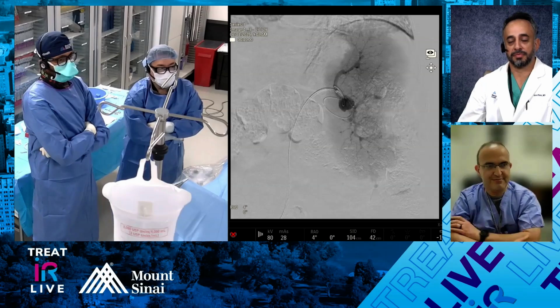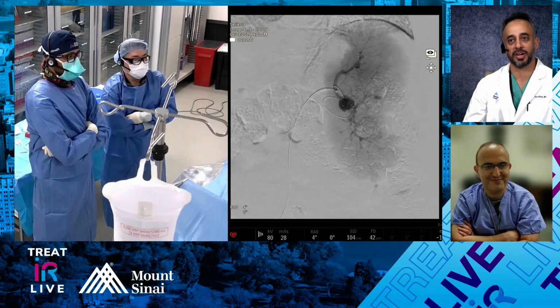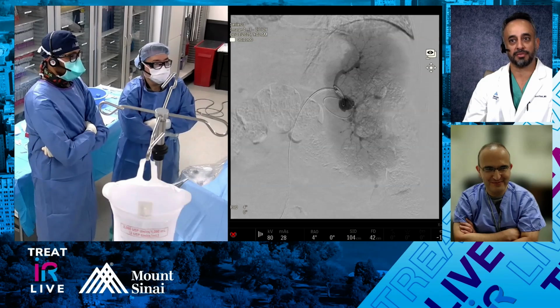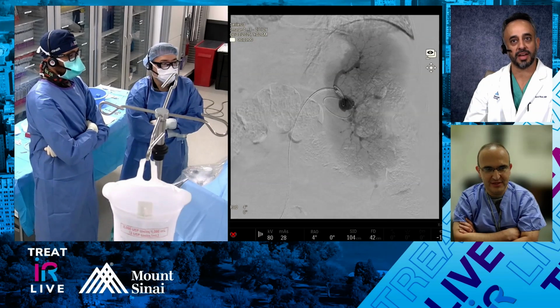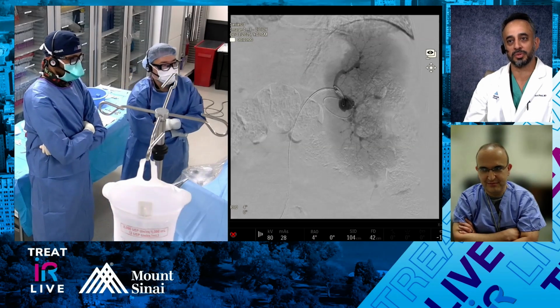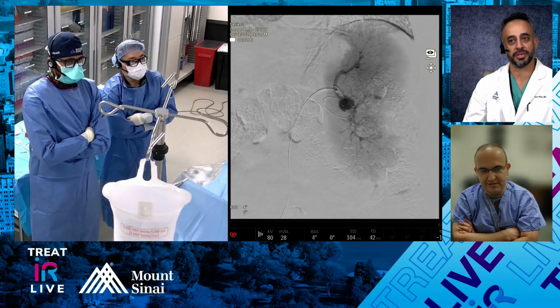I don't know if Dr. Cohen has any different feelings on it, but it always looks like, oh, this would be a great case to do a stent or try to put in a covered stent. And when you get there, there's no way, given all that tortuosity. If you look at the microcatheter whipping around back and forth there, no stent is going to track out there that's big enough. Especially trying to get a Viabahn or a VBX out there. It was very proximal. That's probably where you could do a stent, and then it's sort of pointless at that point, right? Because it's so proximal that it's just easier to coil. What are you trying to preserve at that point?